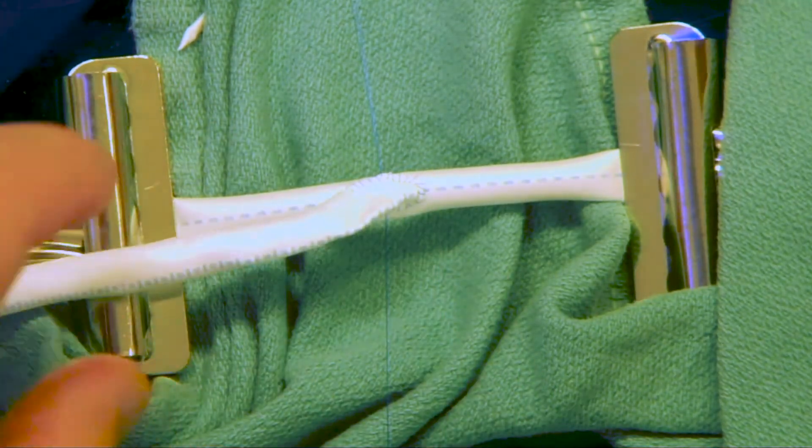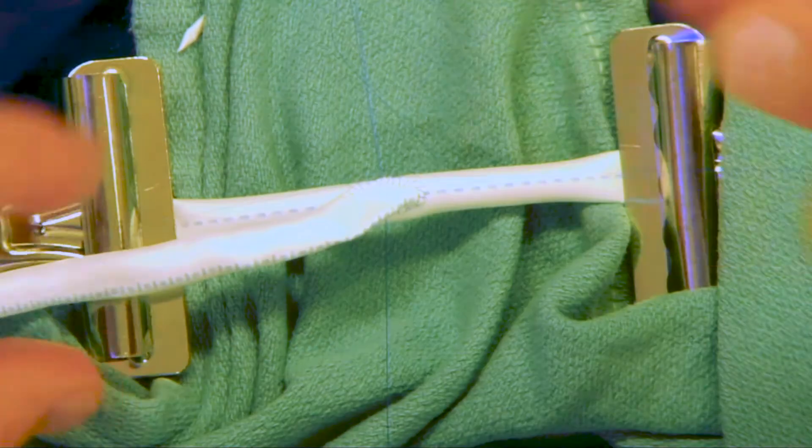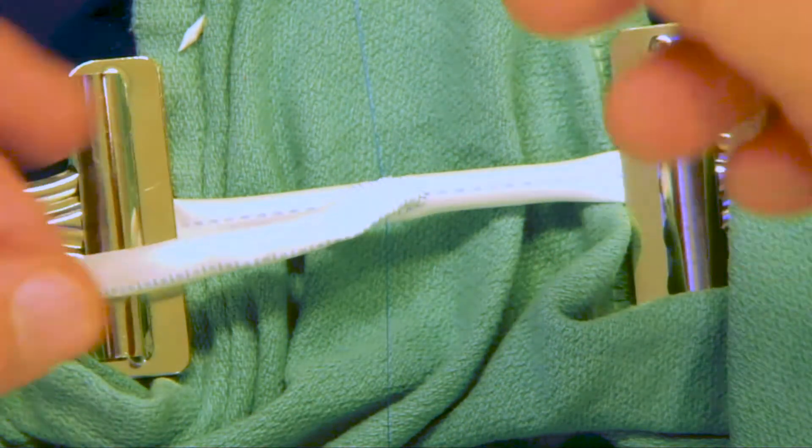Lastly, we'll secure our suture line by tying off the suture. We'll start this off with a slip knot and then do at least five throws with the proline suture in an alternating pattern.